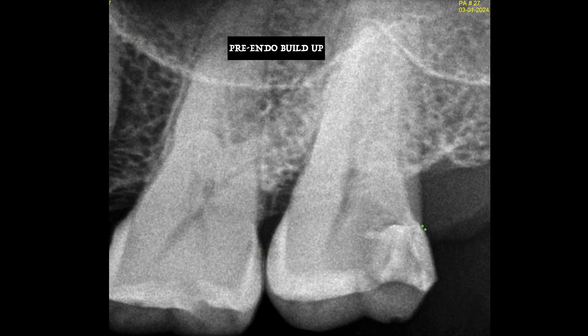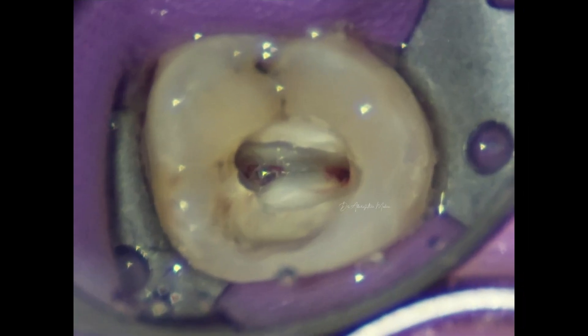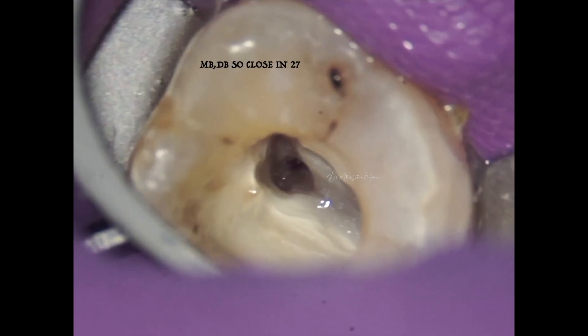We prefer to do the pre-endodontic build-up even before we begin the endodontic treatment so that we can have good leak-proof isolation. The pre-endodontic build-up was done with a Tofflemire matrix and an Ivory number eight band. Once the pre-endodontic build-up is done, you can achieve nice, good isolation even with single-tooth isolation and work stress-free.